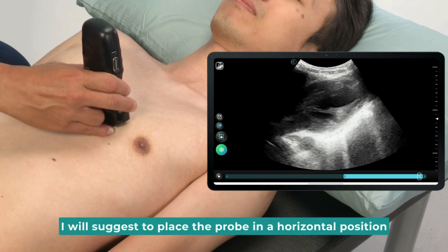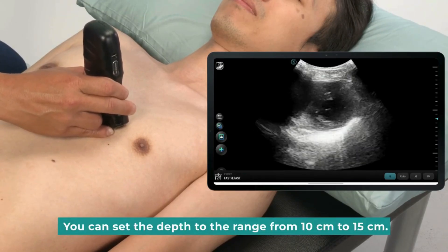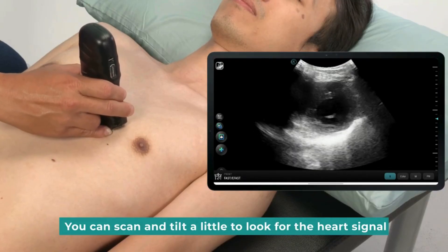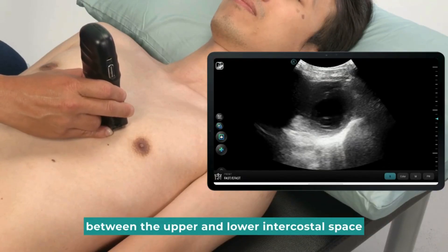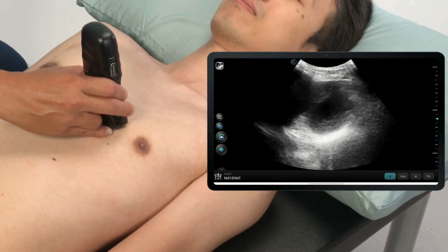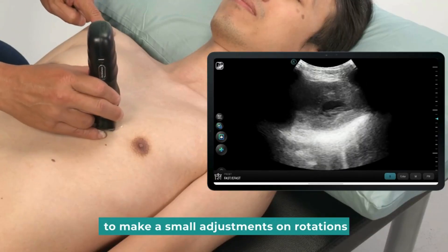I will suggest placing the probe in a horizontal position. You can set the depth to the range from 10 cm to 15 cm. You can scan and tilt a little to look for the heart signal between the upper and lower intercostal space. Since this is not the longitudinal view of the heart, let's place the probe towards the right shoulder to make a small adjustment on rotation.